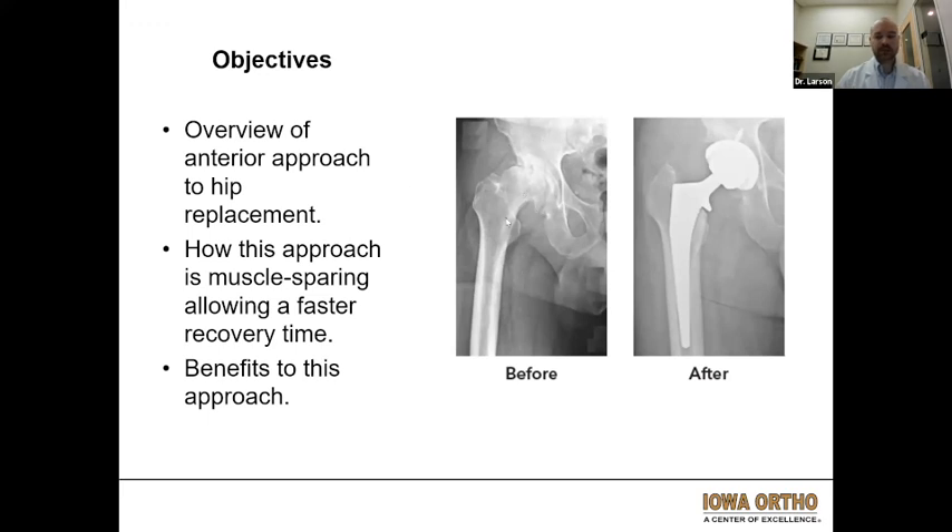This is a good example of a before hip replacement hip. This is somebody who has completely lost all their cartilage in their joint. The ball portion of the hip joint has essentially lost its spherical shape, very worn. And then over on the right here is the after hip replacement view where we see this metal stem, the metal ball portion, and the cup portion replacing that arthritic joint.